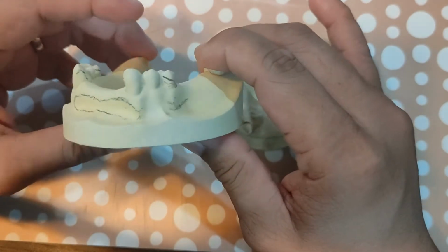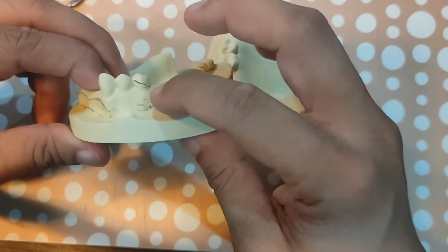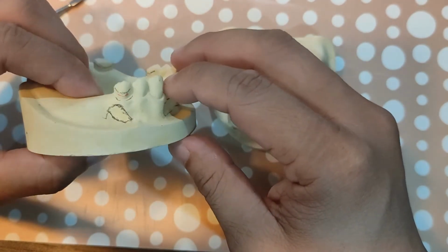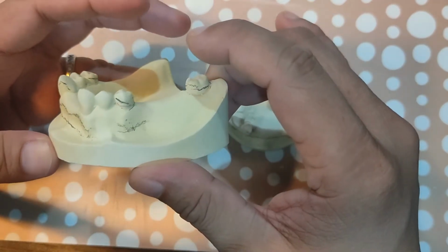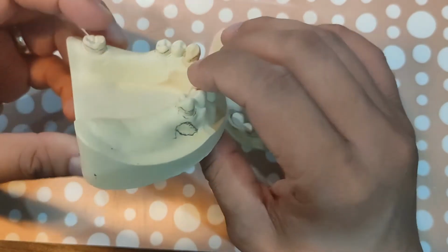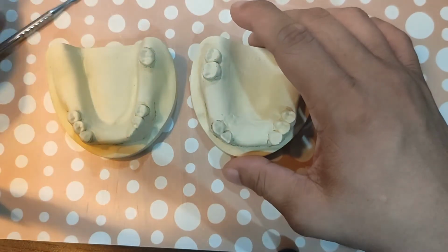Okay. Notice here on the left side, the buccal left side, gingival to the premolar, there was no tissue undercut seen. Okay, pero sa kabila, on the right side, meron. Okay, there's presumptive retentive undercuts.